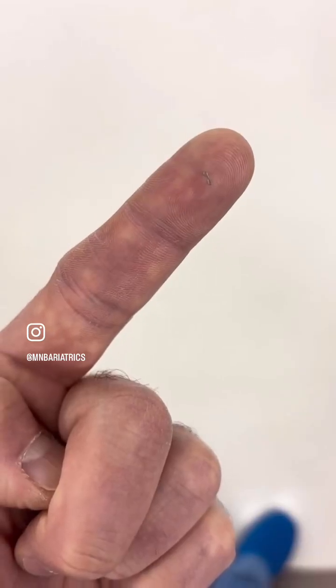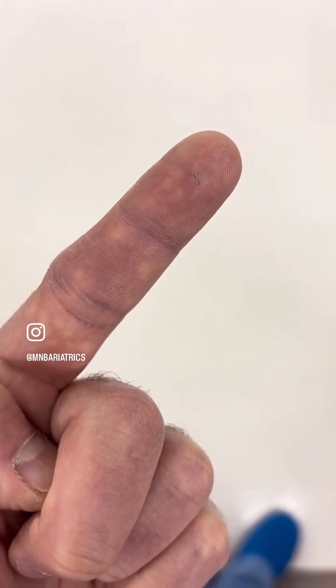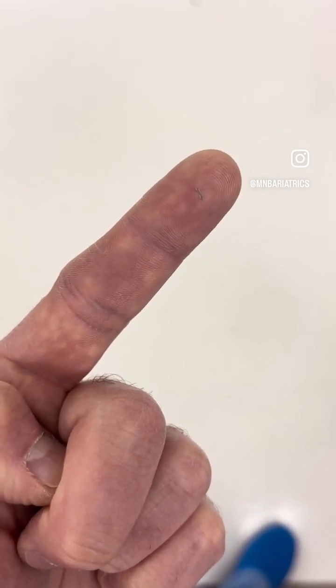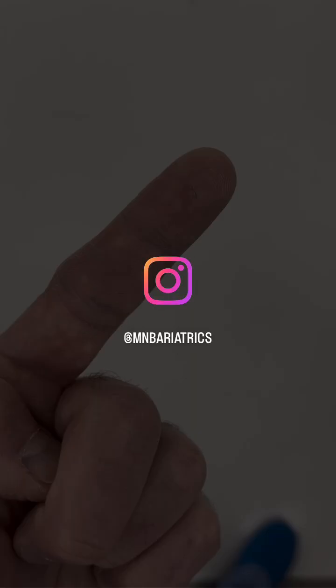And this is how tiny the staples are — you can see them on the tip of my finger. They are made of titanium and they do not cause any problems. They do not react as a foreign body and nobody knows they are there. This is how tiny they are.